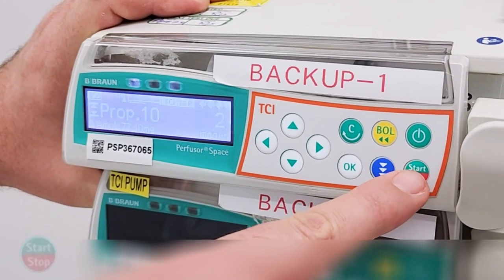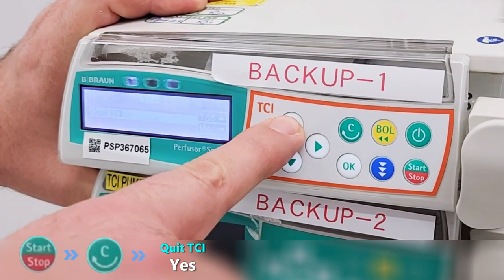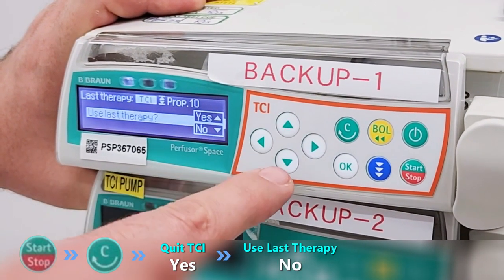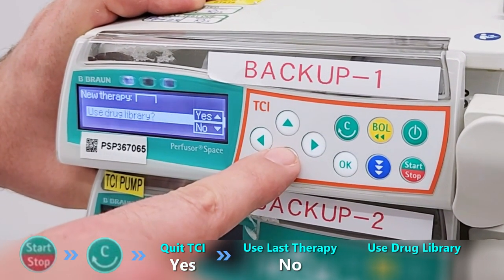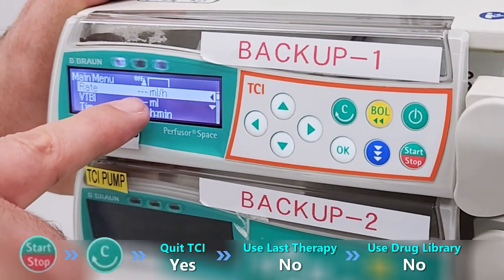To change from TCI to ML per hour, stop the infusion. Press C to quit TCI. Select no for using last therapy, and again select no for using drug library. Now you can use ML per hour.